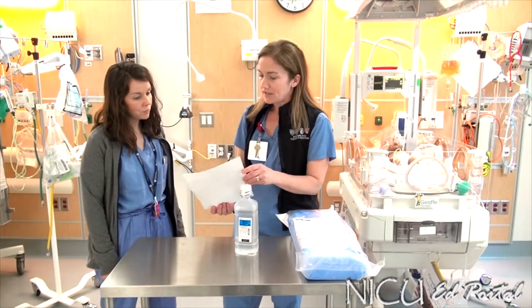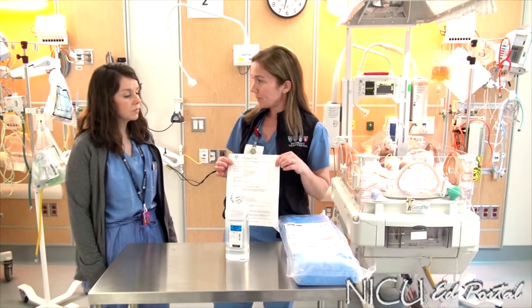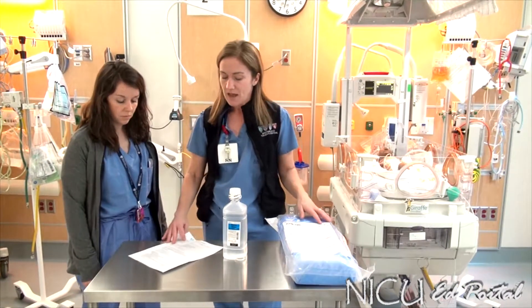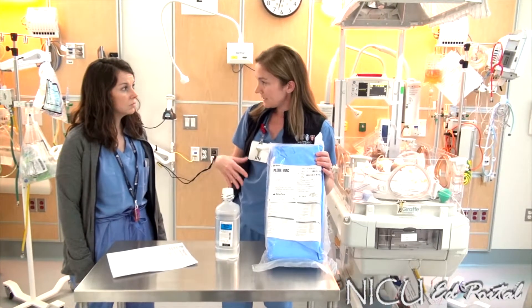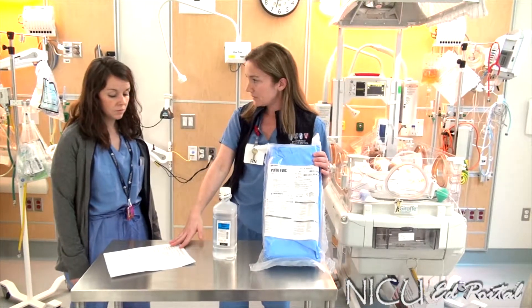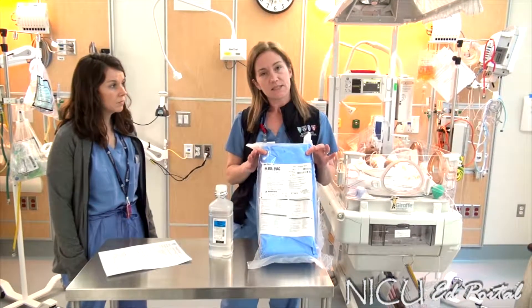Welcome, Joanna. Today we're going to do an in-service training on setting up the Pleur-evac Infant Drainage System. For purposes of this in-service, we're going to go through the equipment that you need to gather, the policy that is available for you to refer to, and then we will walk through setting the system up.